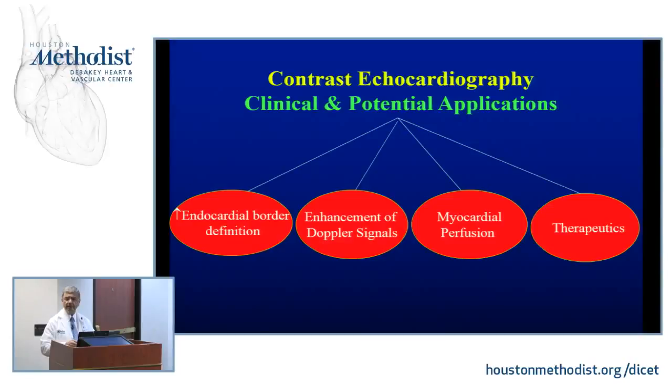There's a lot for that. There is a code for billing purposes, but no reimbursement for that, and it has some challenges nowadays. And for therapeutics, some of these contrasts can tie into a thrombus, and if you insonate them, they may enhance thrombolysis. People have done some of that work. Dr. Porter has done some of that work.